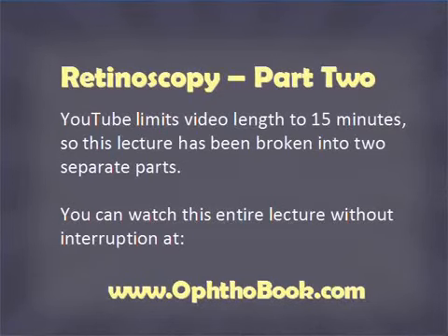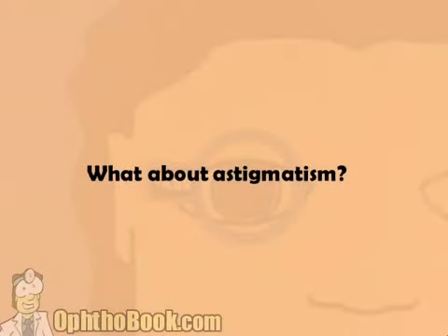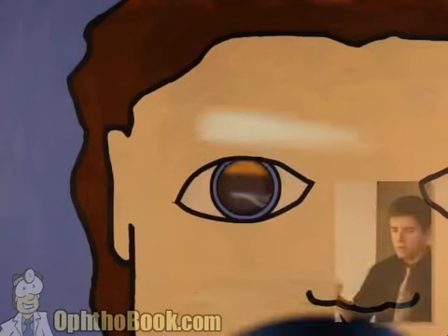to neutralize the reflex. And at the very end, subtract a working distance to come up with your final prescription. So what about astigmatism? Now this has been pretty easy so far. If it was this easy, anyone could do it. It's not an issue. Let's look at another eye.